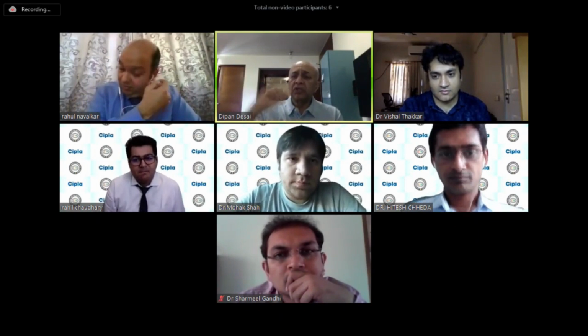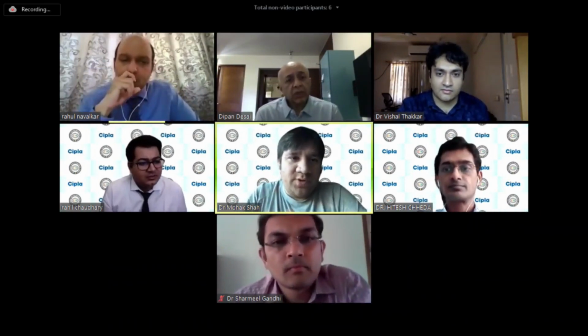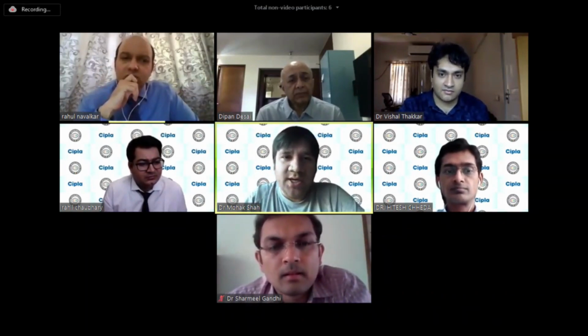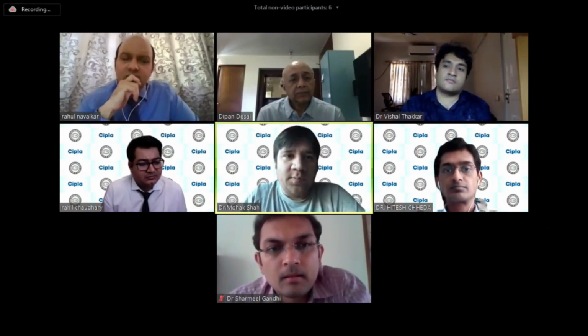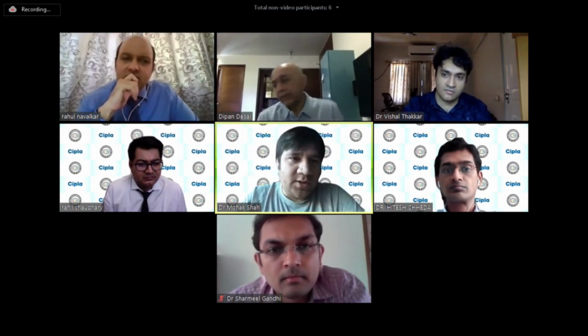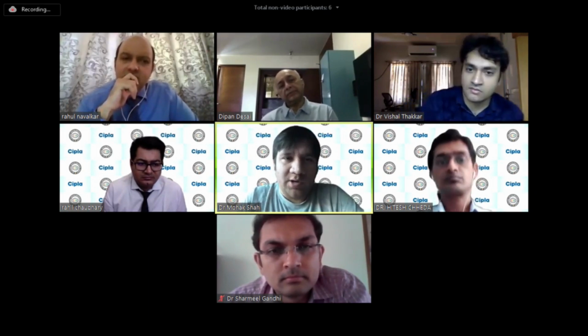Any other suggestions? What he's saying is regarding the first post-op day: you have done the surgery, the lens is well in place, the patient comes the next day. How will you diagnose the problem? First of all, we have to hear the patient's complaint. The patient will immediately complain; if the rotation is more, the patient will complain of blurring of vision. Then we check the patient. And what I usually do is check the patient's vision as well as auto-refractometer.